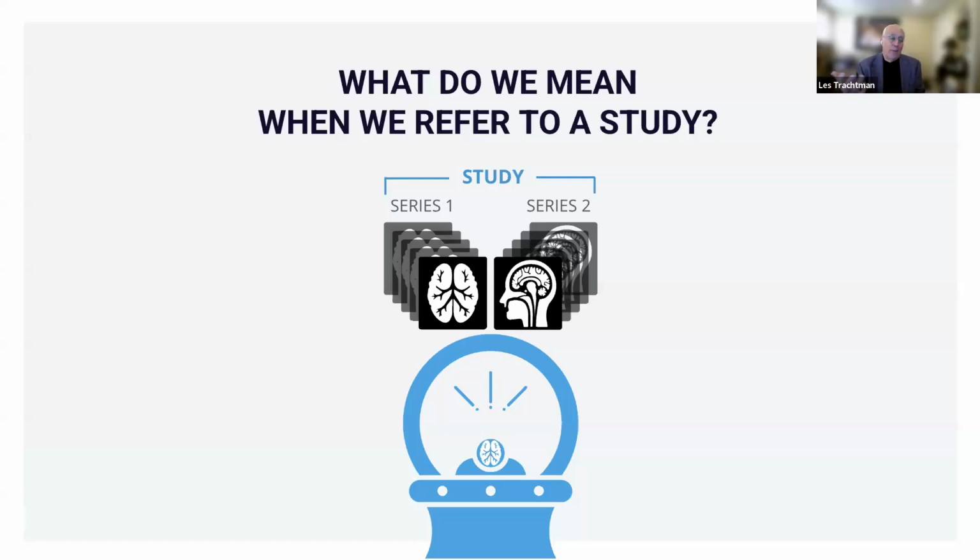It's akin to, I don't know, none of you are as old as I am, but it's akin to when I was a kid, where you got one of those little teeny cartoon books, and you flip the pages with your thumb. And when they went fast enough, it looked like it was a moving picture. That's the same way that we depict multiple dimensions and potentially depict time in something like an ultrasound using DICOM. So it is multiple images that show up together to indicate either a 3D or perhaps a time-based image.